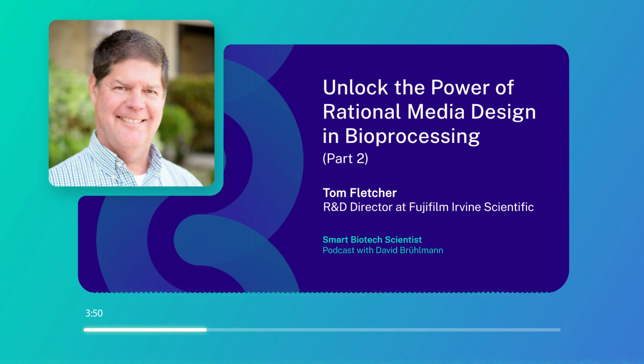And as you know, because your rational media design was focused more on product quality, that's not to be underestimated as a goal. That's something that really needs to be paid attention to and included in this discussion of what am I trying to achieve by adjusting the media. Is it something related to glycosylation, charge variance, the potency of my molecule, post-translational modifications? All of these things can be impacted by culture media.